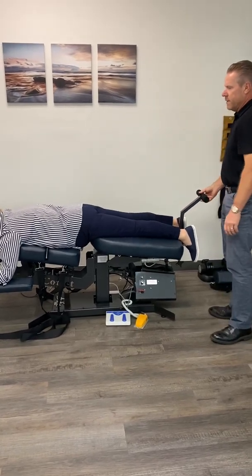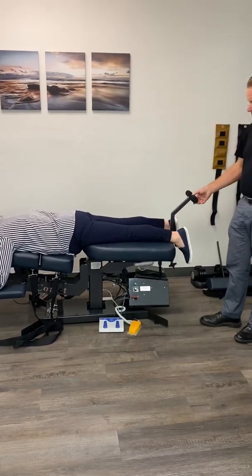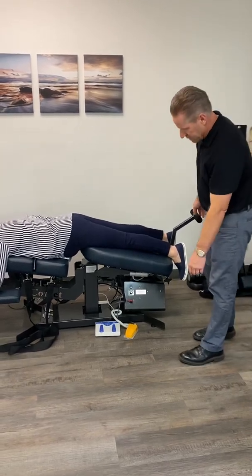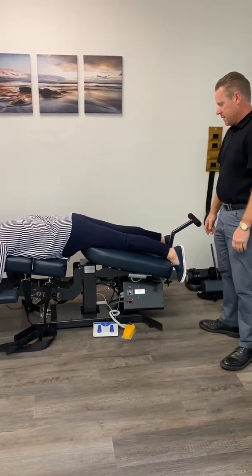And again, if we were going to do a unilateral stretch like that, that's where I'd probably choose to strap in the ankles. But never start with them strapped in. Always warm a person up, make sure they feel okay with it. I'm going to remember to lock this, otherwise getting off of this thing can be kind of dangerous.